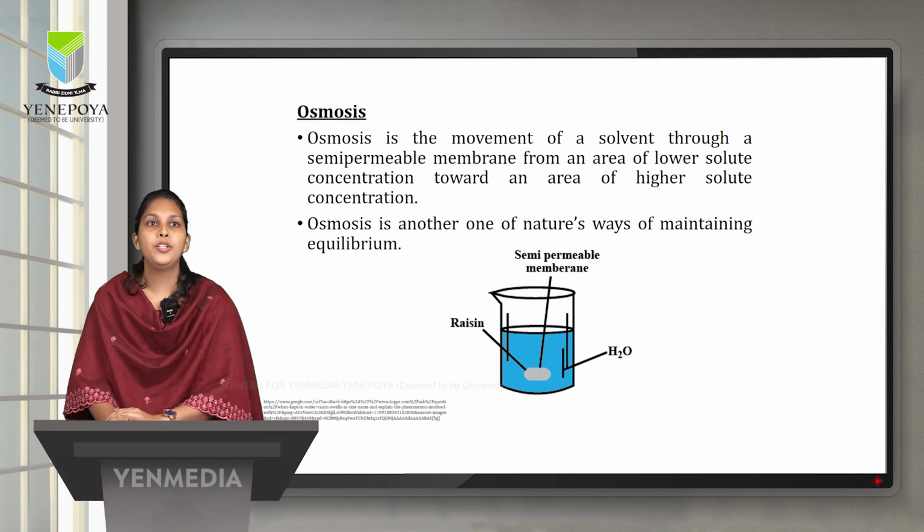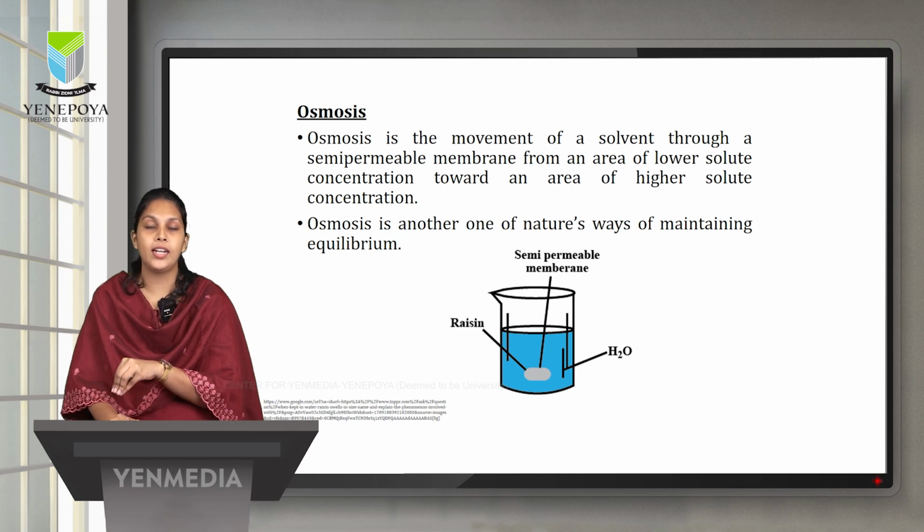During dialysis we use osmosis to remove water from the patient's body. How are we using osmosis? Osmosis for removing water: we create an osmotic pressure gradient in the dialysate.